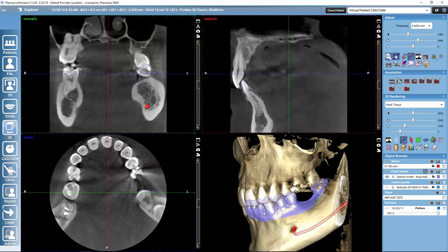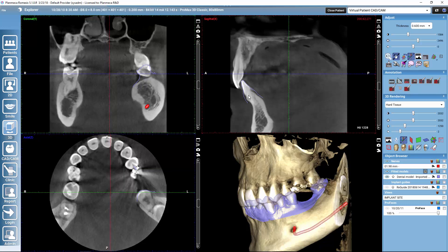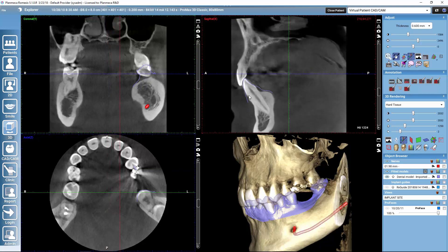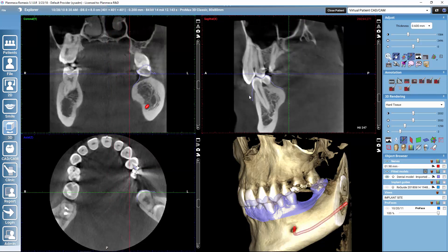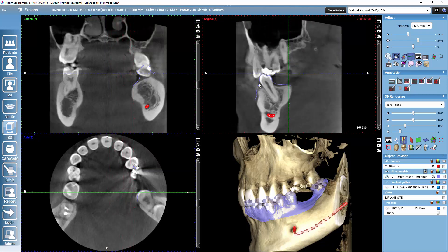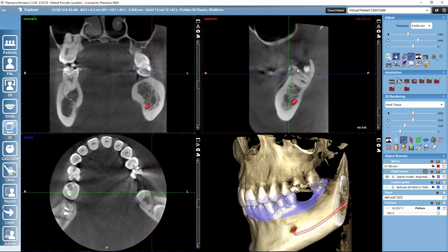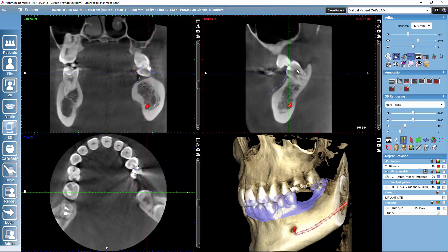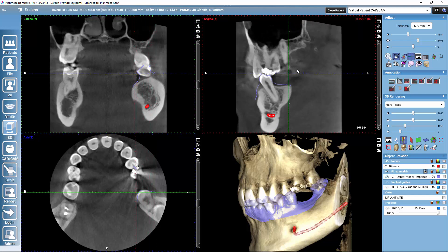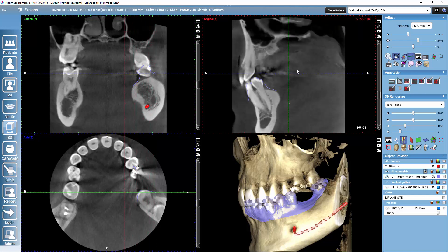After this you can still check the position from the slices. You can scroll the slices and check that it follows the crowns nicely — and we can see that it follows very nicely. So we are happy with the match.